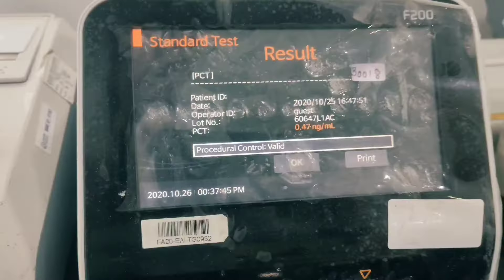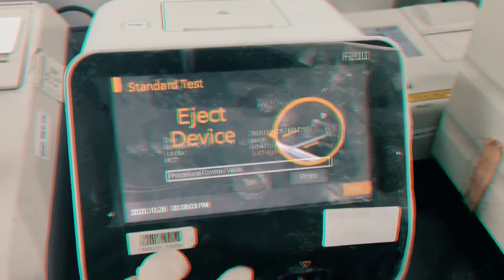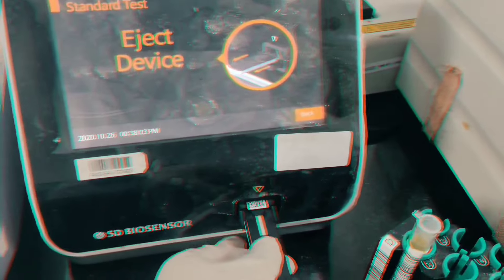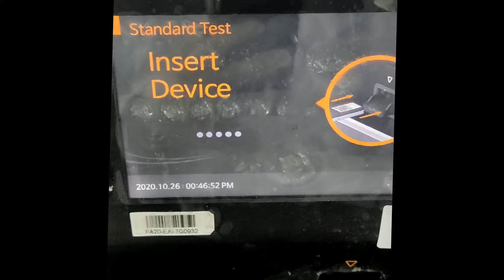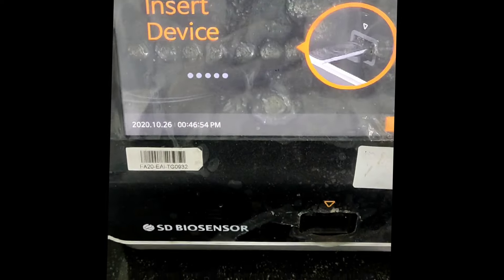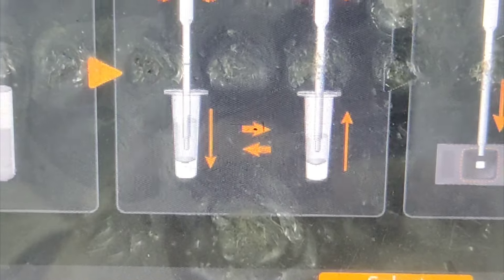Here we perform the procalcitonin test on the SD Biosensor analyzer. We take a sample, enter its ID, and click direct. The analyzer will prompt to insert the procalcitonin kit for scanning validity. Once it has been perfectly scanned, it will display the entire procedure on screen.